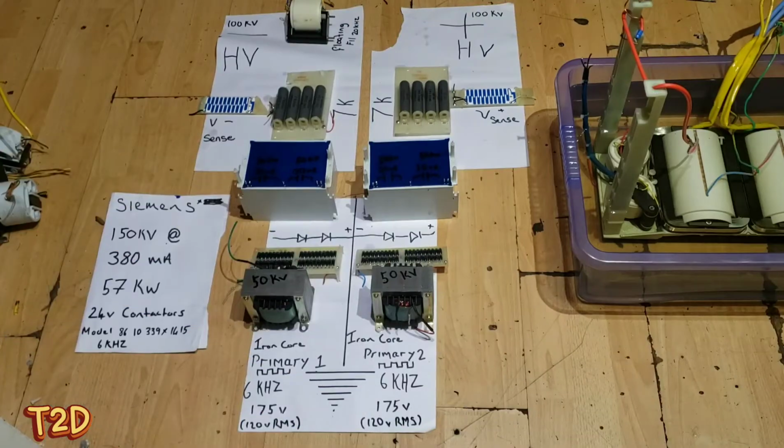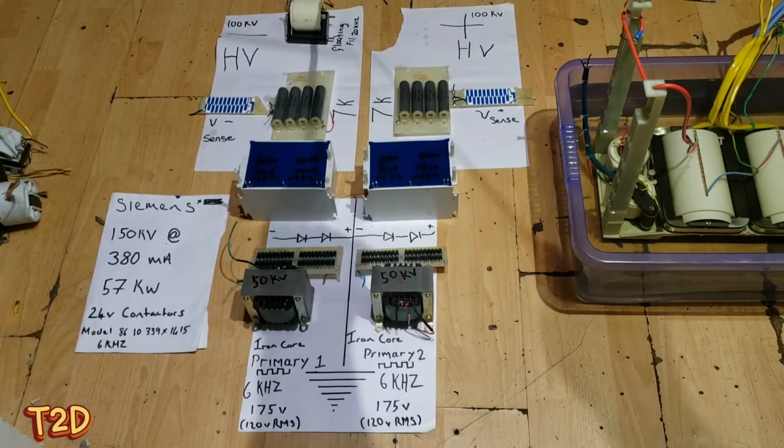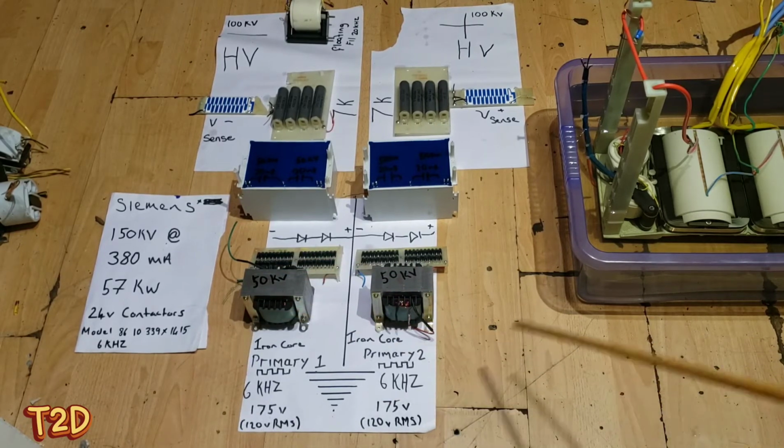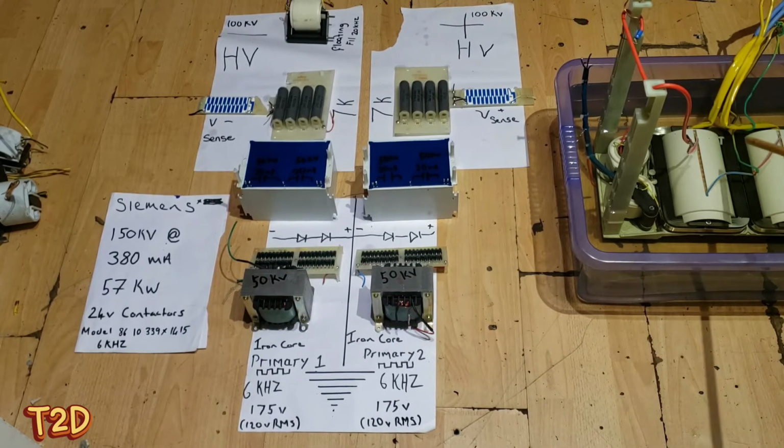Right then guys, so all these are actually the genuine components from one of these tanks, except of course these transformers. The original transformers are here off to the right, and we'll take a close look at those now.